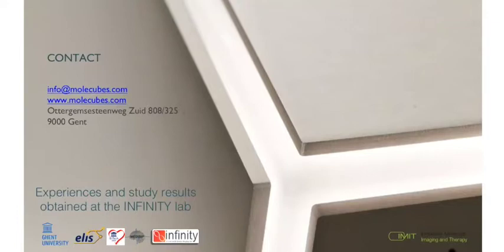Yeah, so one of the questions was which activities you would recommend for standard scans of mouse and rat studies. For mouse scans, I would recommend you use more or less, let's say, 2 megabecquerels or 50 microcuries to inject. And for the larger rats, I would go to, let's say, 7 megabecquerels, so it's more or less 150 to 200 microcuries. I would not change this activity if you do dynamic scans. I would use the same activity.